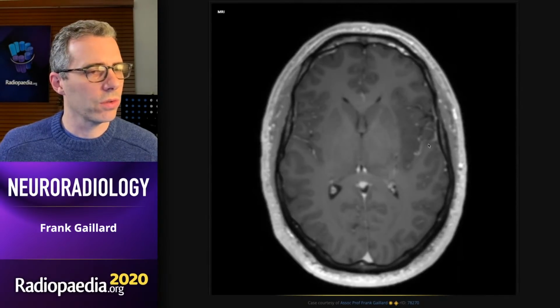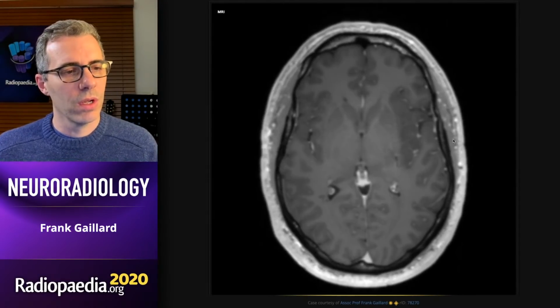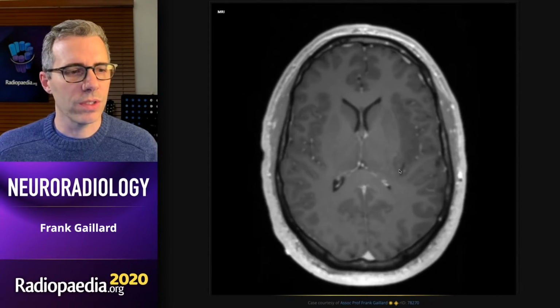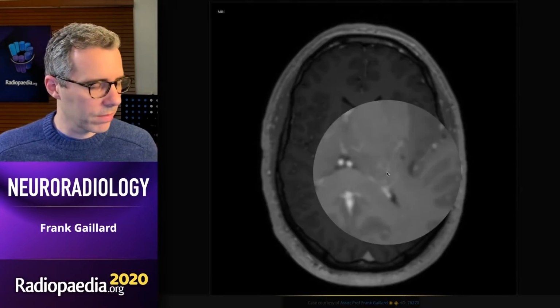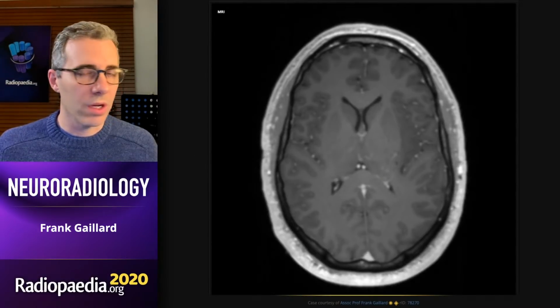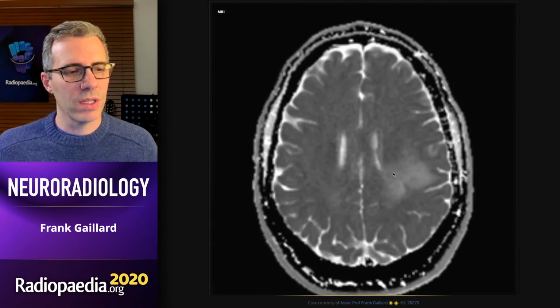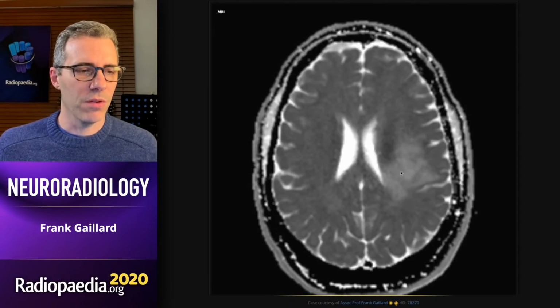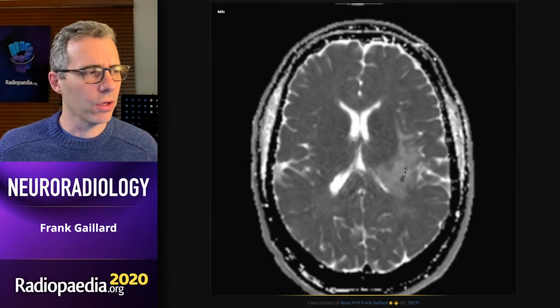If we go on to contrast, because we don't want to spend our entire life looking at this, we're not actually issuing a report. We don't see any contrast enhancement except maybe a little bit around these low T2 signal regions. Some of these are vessels. Right? You can see enlarged vessels coursing towards this lesion. And if we go to ADC, we don't need to look at the DWI because we know where to look. See mostly facilitated diffusion, so it's brighter than normal white matter. And if you measured this, you might get 1400, say. Except for these areas that are very low.